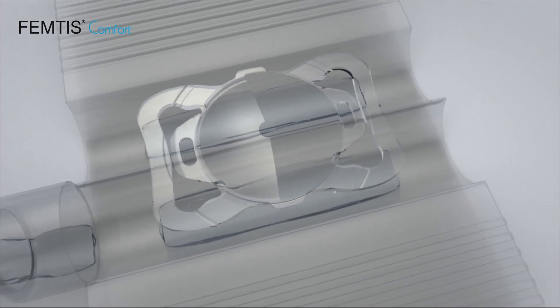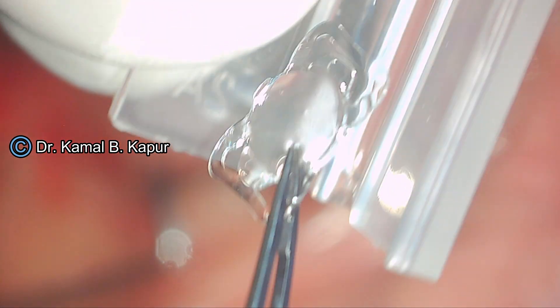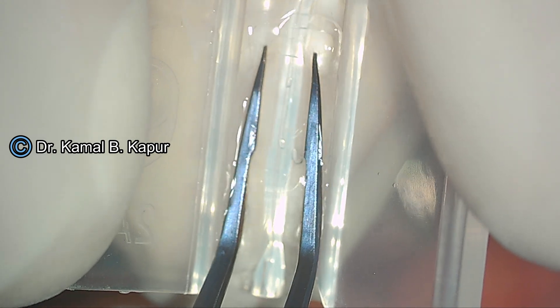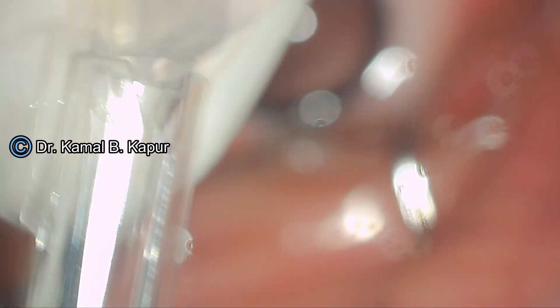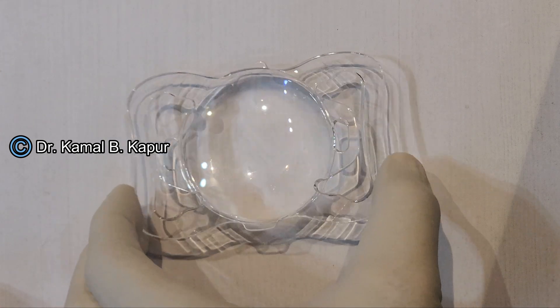The IOL is placed into the cartridge, with two leading side channels and the left trailing side channel. You can also have one right leading side channel and two trailing side channels. The lens will be placed entirely in a butterfly cartridge after the viscoelastic has been placed. Make sure there is not much viscoelastic in the cartridge, otherwise the lens will float on top of that. Load the butterfly cartridge.